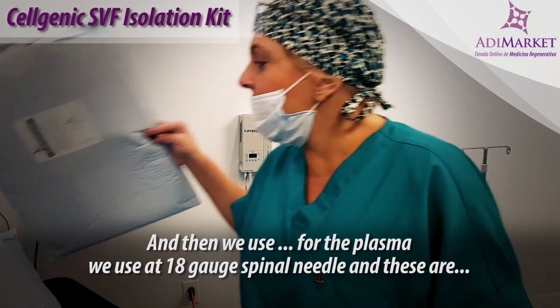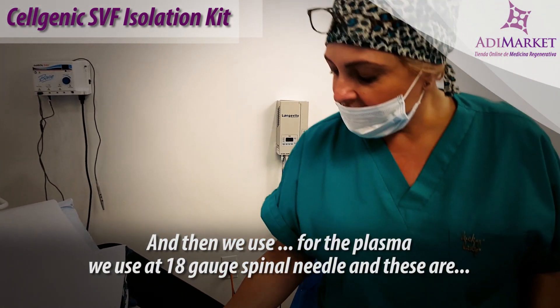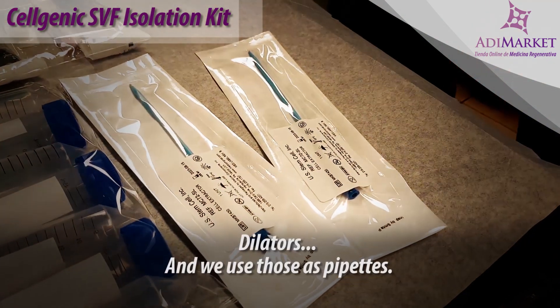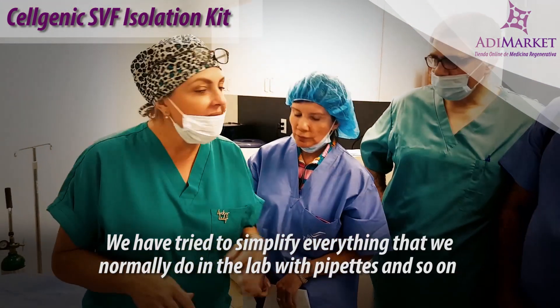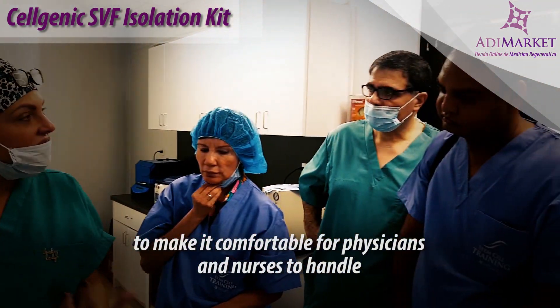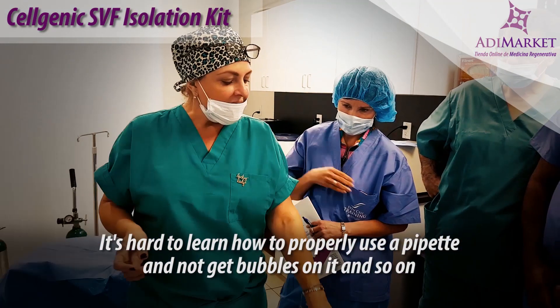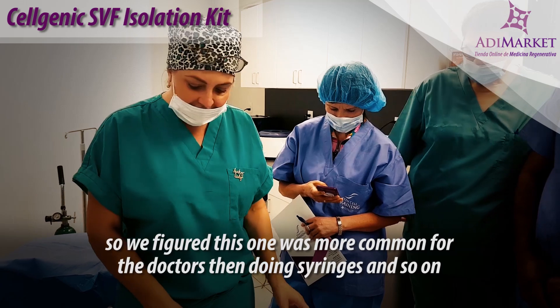For the plasma, we use an 18 gauge spinal needle, and we use those as pipettes. We have tried to simplify everything that we normally do in the lab with pipettes and so on, to make it comfortable for physicians and nurses to handle. It's hard to learn how to properly use a pipette and not get bubbles, so we figured using syringes was more familiar for doctors.